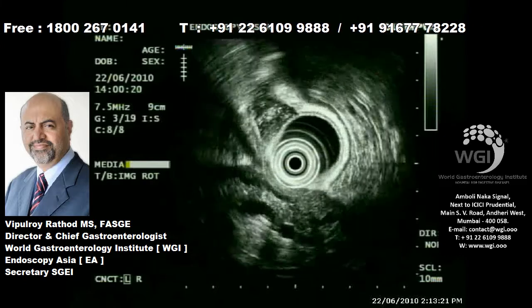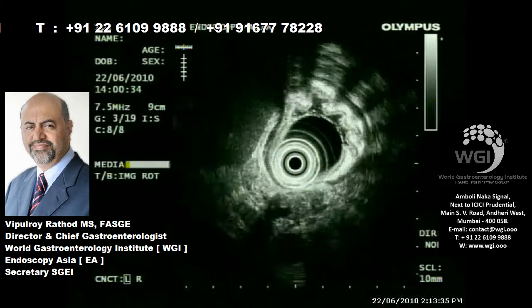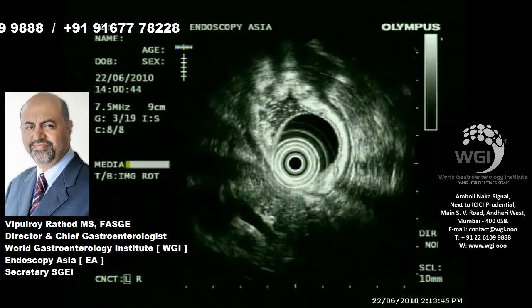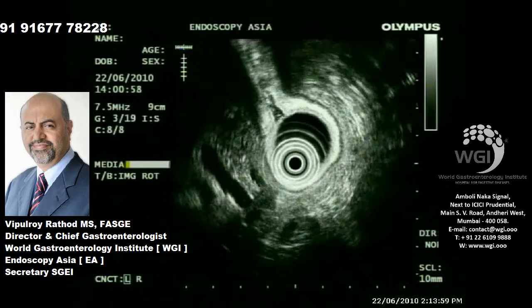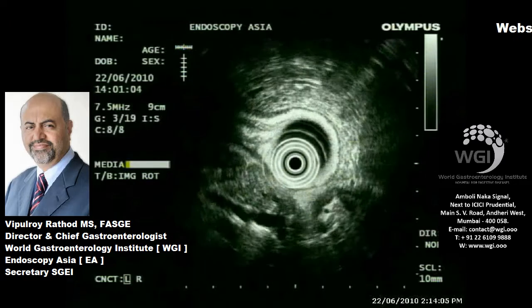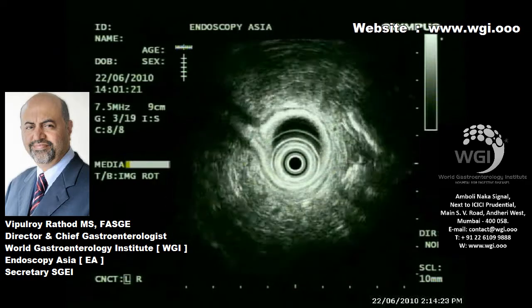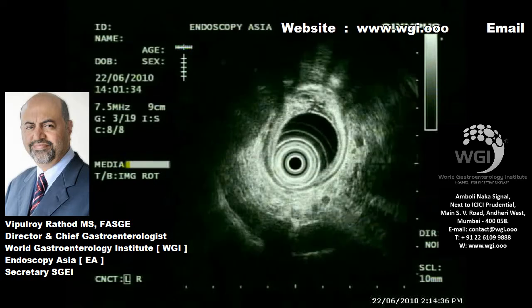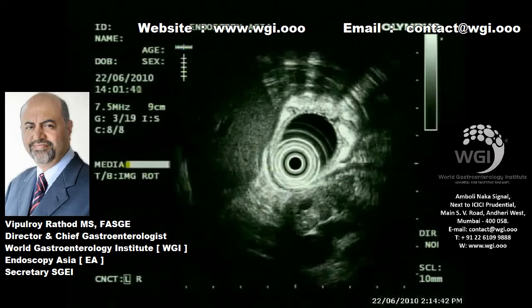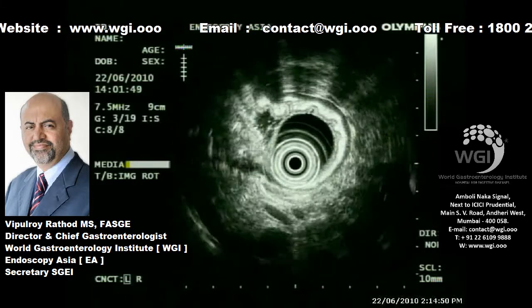Radial evaluation allows you to have an overall mapping of the gland, detection of lesion, diagnosis of lesion with the help of EUS FNA, and eventual palliation of cholestatic symptoms with ERC and placement of a self-expandable metal stent. So this patient has cholestatic symptoms, total bilirubin almost 25 milligrams %, with severe cholangitic and cholestatic symptoms. We are still evaluating the celiac artery.